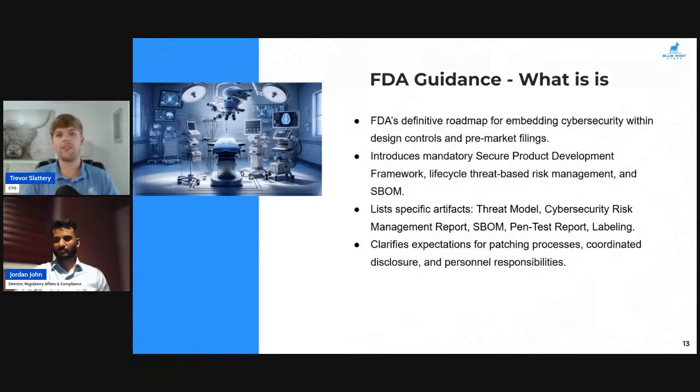This is where we see references to IEC 62304. So the FDA guidance is talking about all of these other standards and how they can interact in different ways to ensure that we have complete coverage about security for the device.